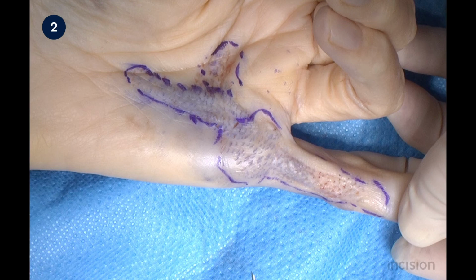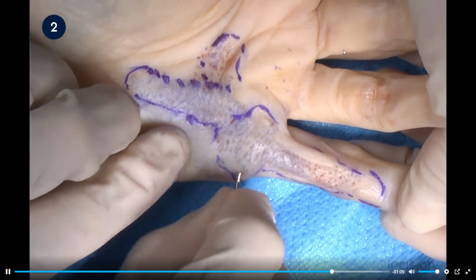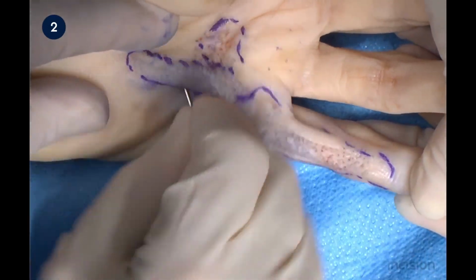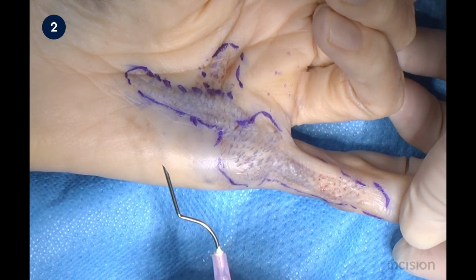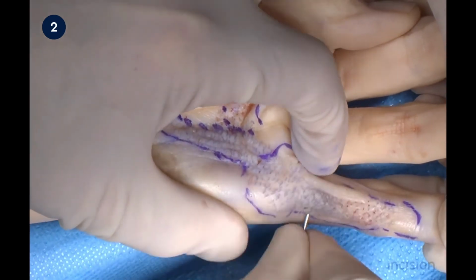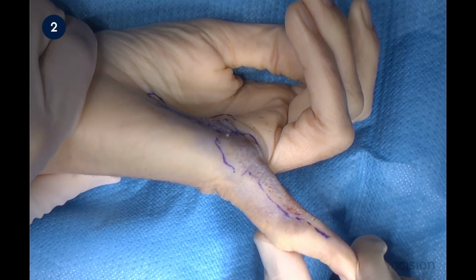The needle is used for the transection as well. Note that the needle is introduced from the lateral side just under the skin. The point of the needle is moved very superficially, just underneath the skin, as deeper introduction may injure the nerves or arteries in this area. The needle is bent as shown here, which makes staying superficial easier. After all connections are transected and a plane is created between the skin and the underlying pretendinous cord, the finger is examined. Note that the metacarpophalangeal joint and the proximal interphalangeal joint can be extended, which was not possible preoperatively.